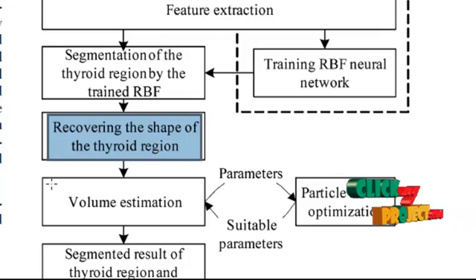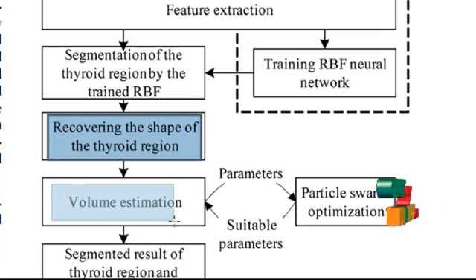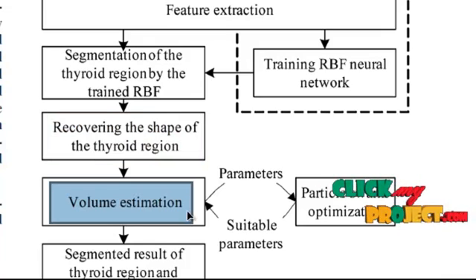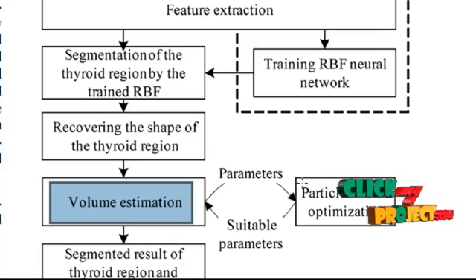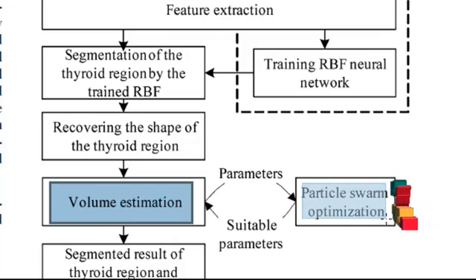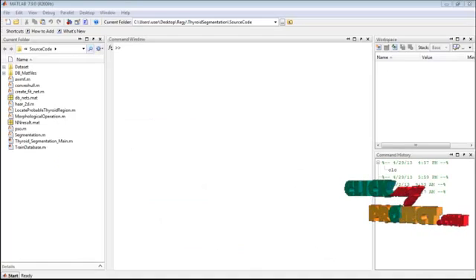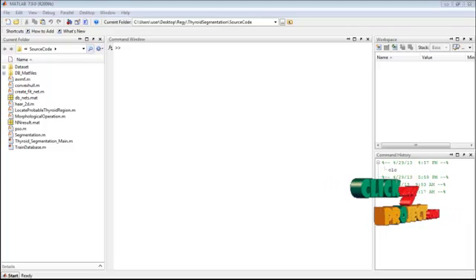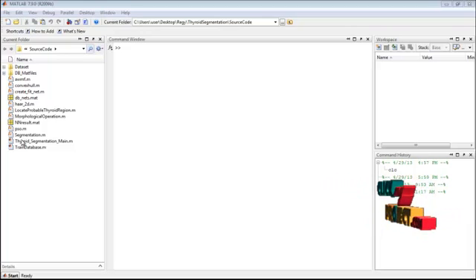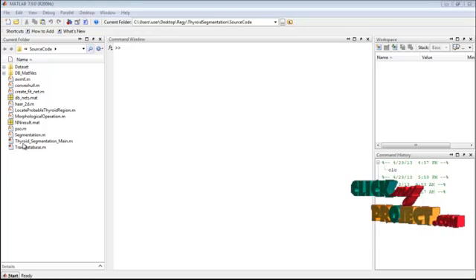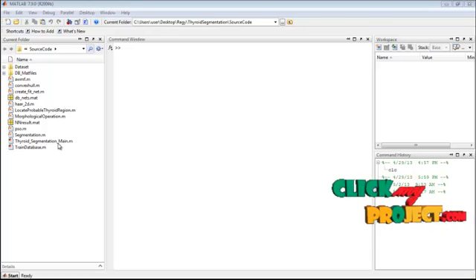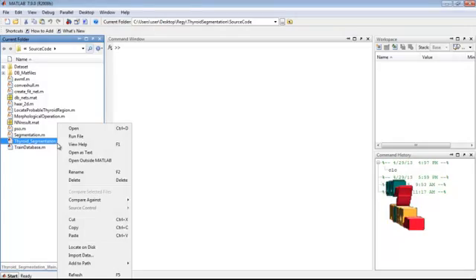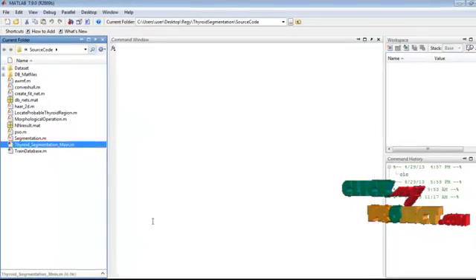Finally, the volume of the segmented thyroid region is estimated using particle swarm optimization. Now we will see the demo of this project. To execute, right-click on the thyroid segmentation main .m file from the source code folder and select Run File.